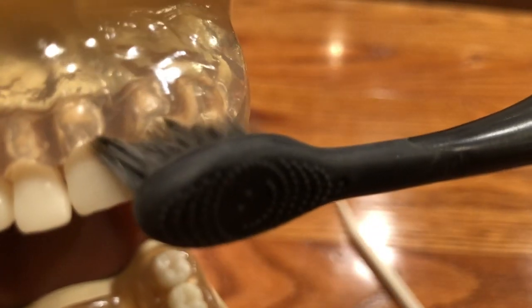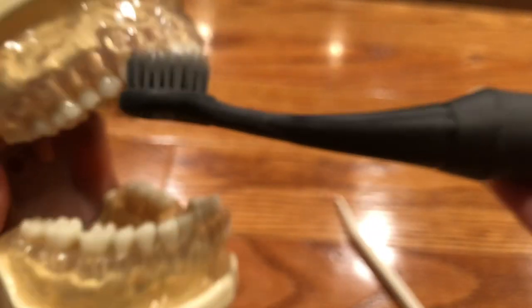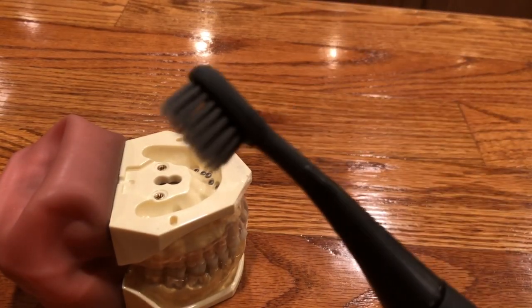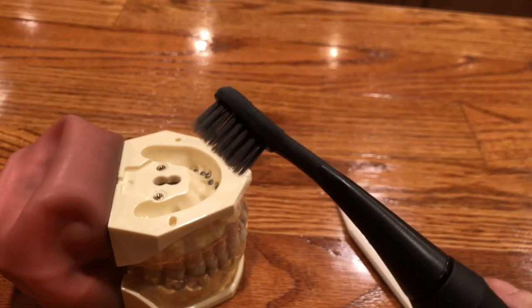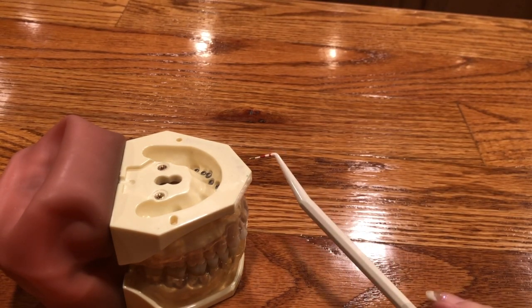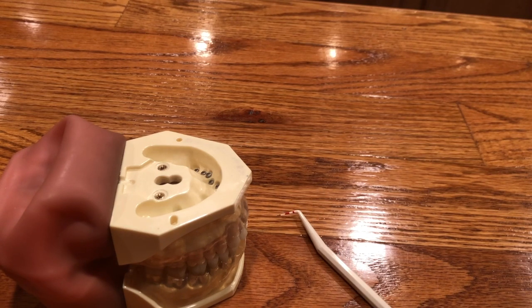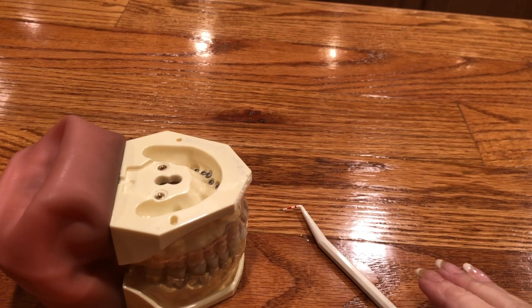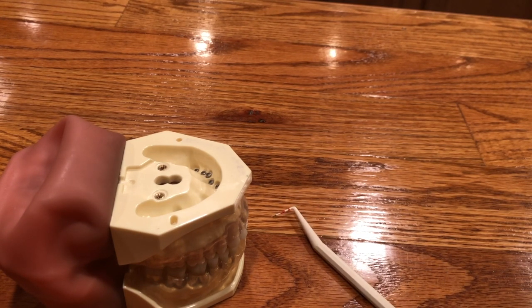And just keep moving. So I know that this was a really long video, but this is Know Your Numbers. This is how an electric toothbrush can get down below there and clean that out, and what a probe actually does and what your hygienist is doing when she calls out the numbers. If you're going to a dentist and they're not taking these numbers, sometimes they just don't tell you, they don't call them out loud, but you need to know, you need to ask.